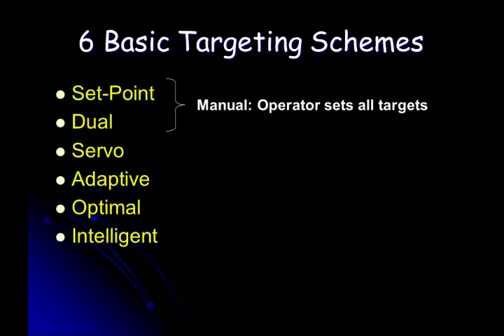So say a home care ventilator. Are they simpler to use? Oh, yeah. As we go down this list, they get more complex. Open loop isn't bad, it's just that the potential for problems to happen because of other factors goes up.